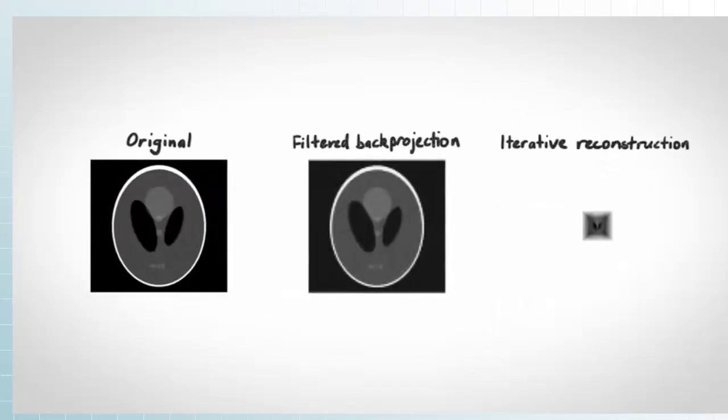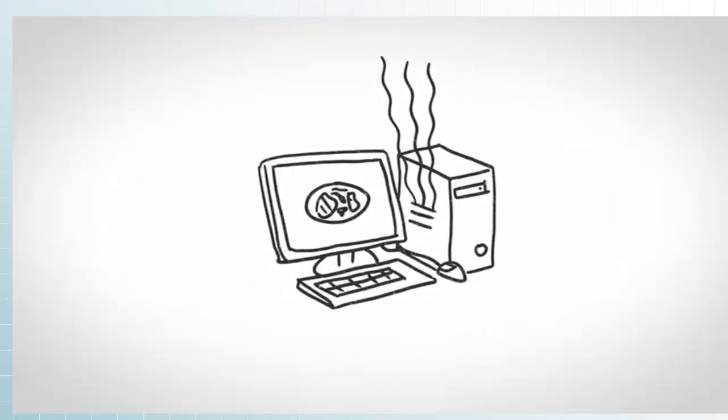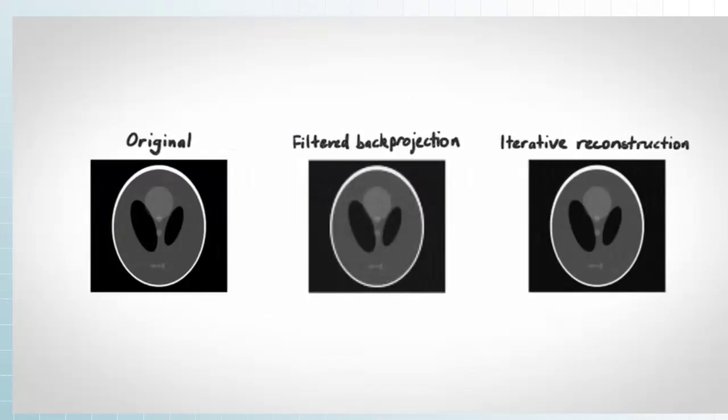Well, amazingly, this guess and check method produces higher quality images at the same radiation dose. You can see in this comparison here. The only downside is that iterative reconstruction takes a lot of computing power and time. So up until recently, filtered back projection was the industry standard.